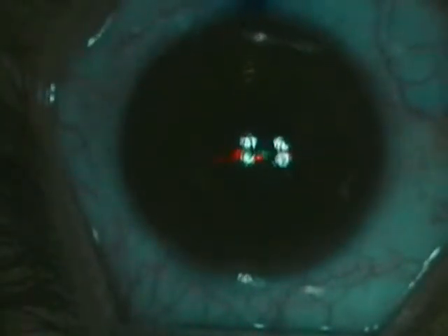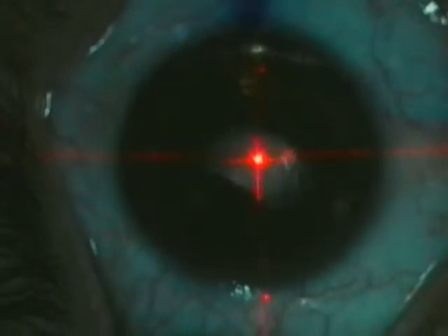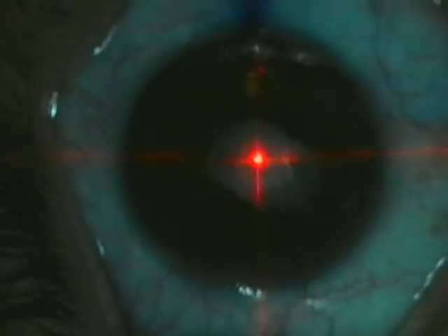Corneal opacities and surface irregularities due to multiple causes represent the most common indications. We must, however, differentiate if vision is impaired because of the irregularity of the anterior corneal surface or due to the corneal opacity. In many cases, the regularization of the anterior corneal surface allows patients, even those with deep corneal stromal opacities, to have a significant improvement in vision. Like in the first example, which improved from a best corrected vision of 20/40 to an uncorrected vision of 20/25 1 month after custom topo-guided surface ablation with PTK for epithelial removal.